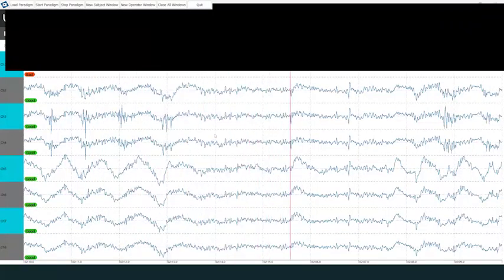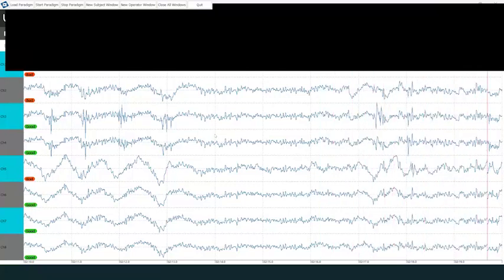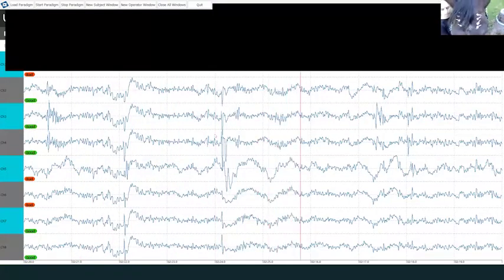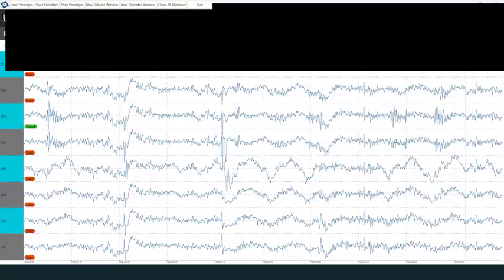So now we are even getting alpha bursts. Trimi gets relaxed. Here you can see, for example, in the middle of the screen, some alpha bursts. Yeah, he's very happy. Now you heard a loud noise again in the background.